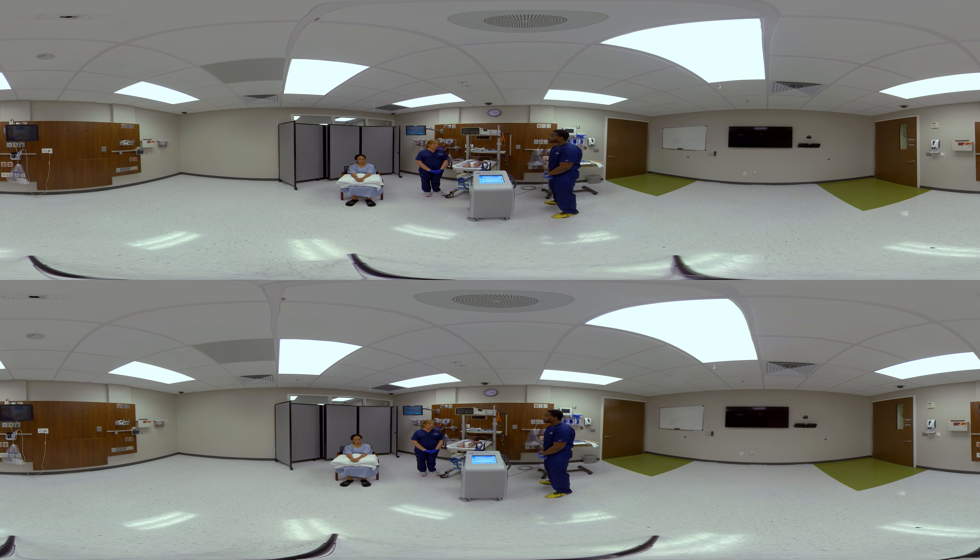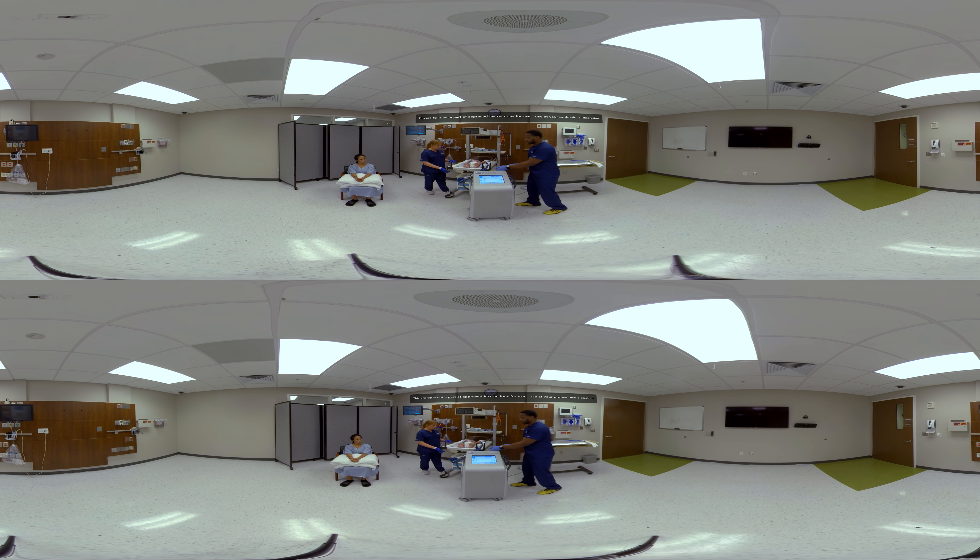If appropriate, you can have the mother hold the patient throughout therapy. You can also reposition the patient on the Arctic gel pad as you normally would during your normal care. In order to transfer the patient, ensure that the mom is seated in a comfortable position near the isolette. Then we can simply transfer the patient while they remain on the Arctic gel pad. We'll want to make sure that the pad stays in between the mom and the patient in order to avoid transferring heat from the mom to the baby.